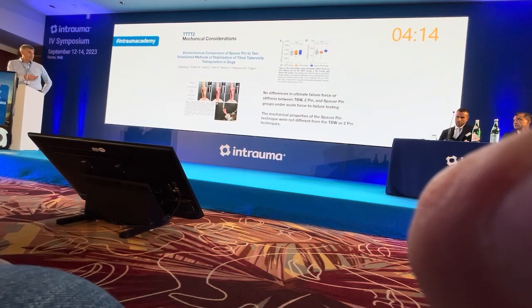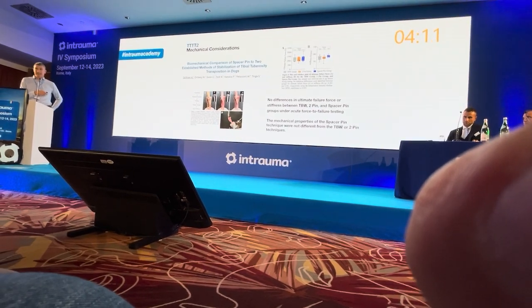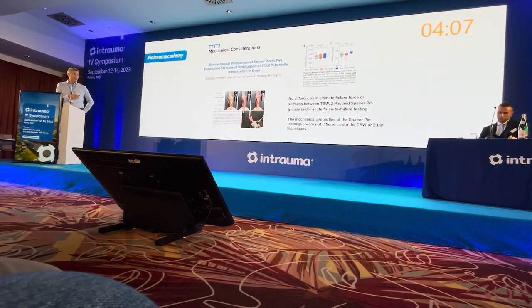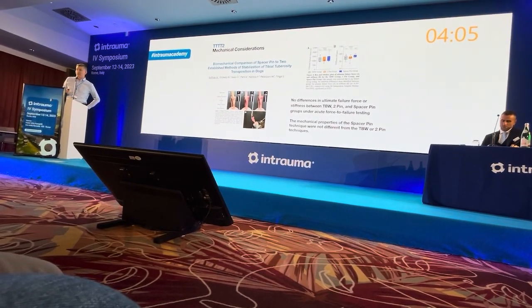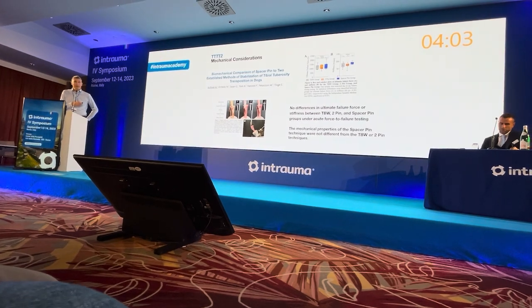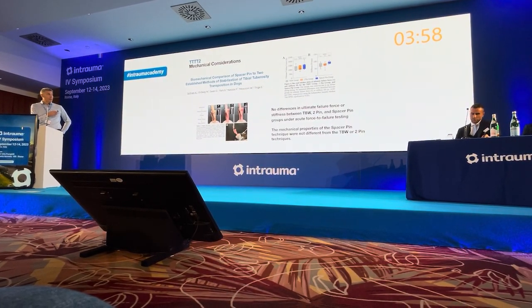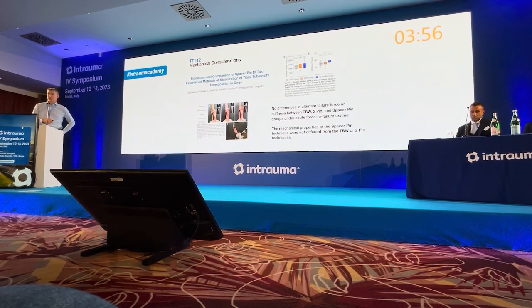And most importantly, the mechanical properties of the spacer pin technique, the TTTT, were no different from the tension band wire or 2-pin techniques. And while not statistically significant, the 4T technique demonstrated the greatest ultimate failure force over all techniques.